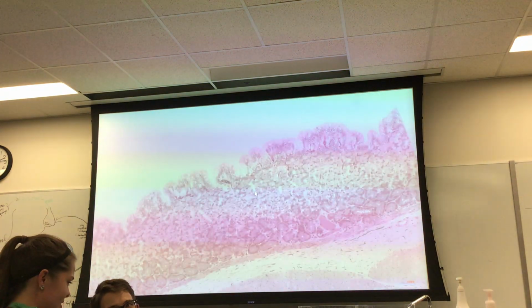Okay, this is going to take a little talking, just to make this clear. If I told you that this was the stomach, and then we moved across here like so, came to this edge of the tissue section, increased our magnification, and then I pointed to these cells right here. Again, this is really putting your gross anatomy knowledge to use. What would you call that, first of all, as a tissue? Skeletal muscle, not even close.